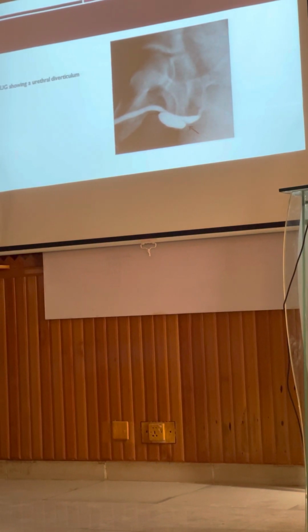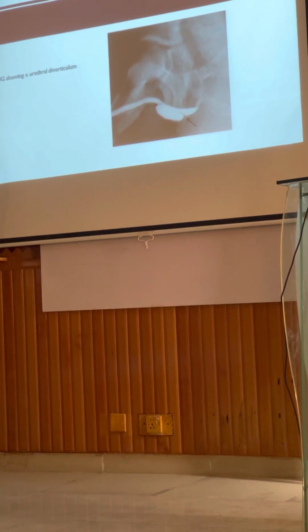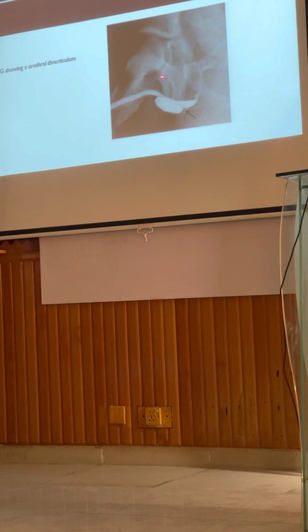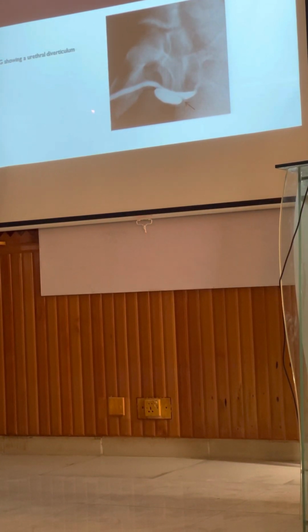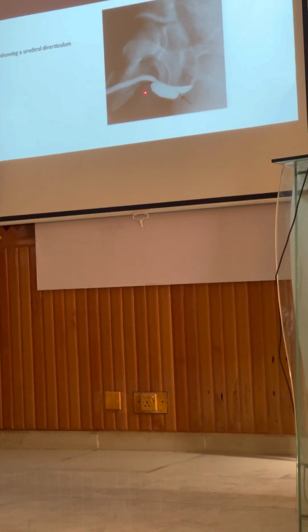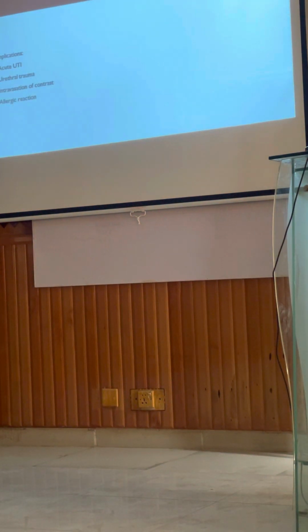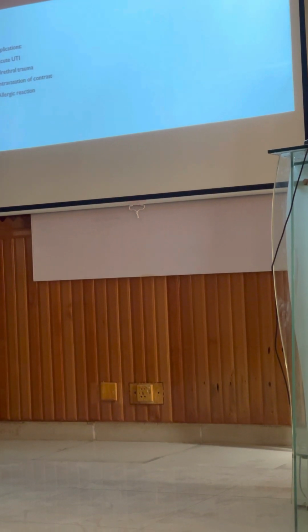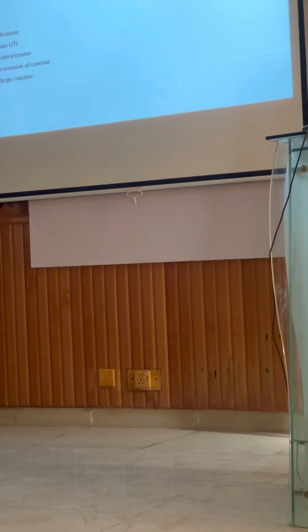Now, a retrograde urethrogram can also give us reliable information about a diverticulum. You can see here this diverticulum. The contrast has been injected, and here you can see a ballooning of the urethra, which is basically a diverticulum. So we can conclude that the retrograde urethrogram is very useful and can provide several types of information. Now, what are the complications of this retrograde urethrogram?